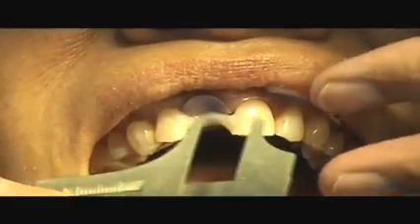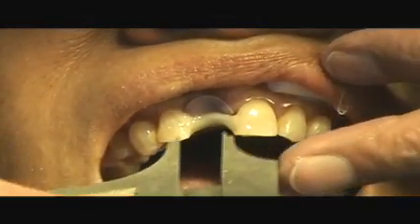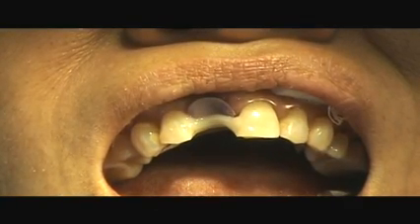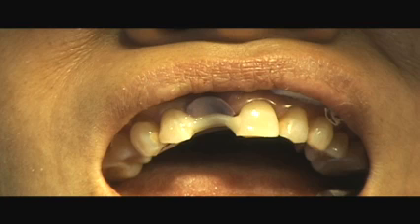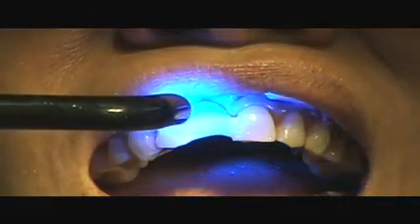Measurements of the width of the left central incisor tooth number 9 are made, and then compared with the edentulous space to ensure proper mesial distal spacing for composite application and build-up next. A third layer of core material is applied and cured.